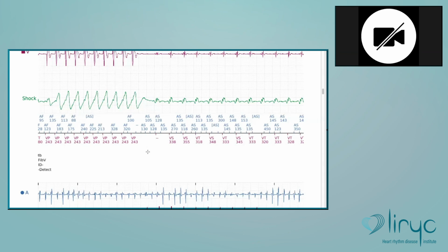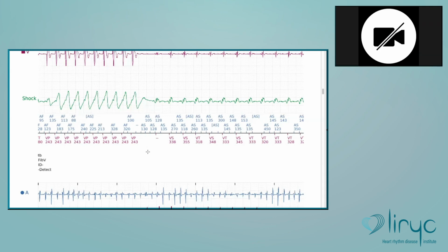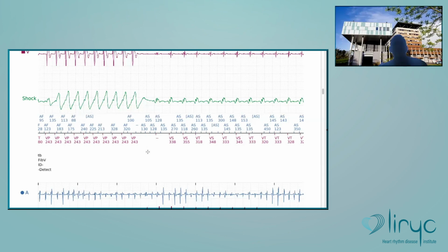Yes, I have a question actually for the post-shock discrimination in dual chamber device. So all the criteria work except rhythm ID, the correlation. Yep, the onset does not work, and the correlation doesn't work. What works will be SRD, so sustained rate duration, V faster than A, atrial fibrillation, stability.